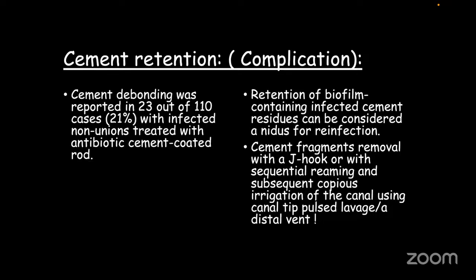Retention of biofilm containing infected cement residues can be considered a nidus for reinfection. Hence, every attempt must be made to remove the nidus of infection, that is the retained cement. So unless you remove that, you should not use cement again if you're doing it for exchange. Cement fragments should be removed with a J hook or with sequential reaming, followed by copious irrigation of the canal using a canal tip, pulse lavage or a distal vent.